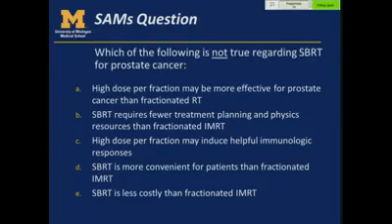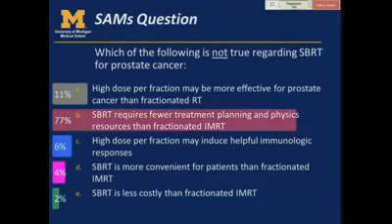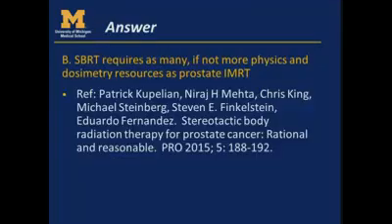SBRT is more convenient for patients than fractionated, or SBRT is less costly than fractionated. Sorry, those were kind of long answers. Okay, correct. Of course, SBRT doesn't require fewer, it's just as many, if not more, when you're doing SBRT.